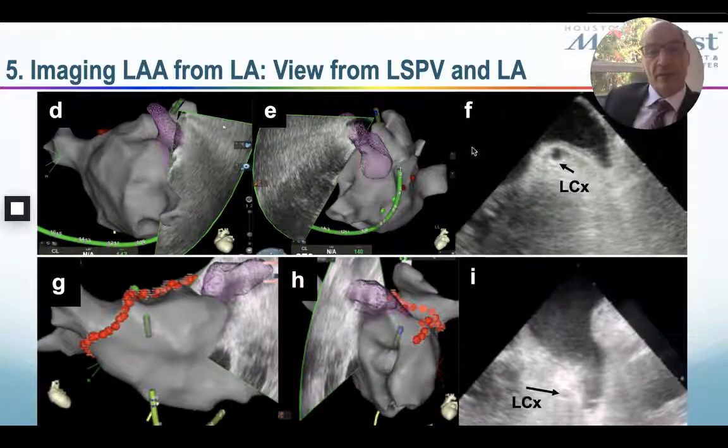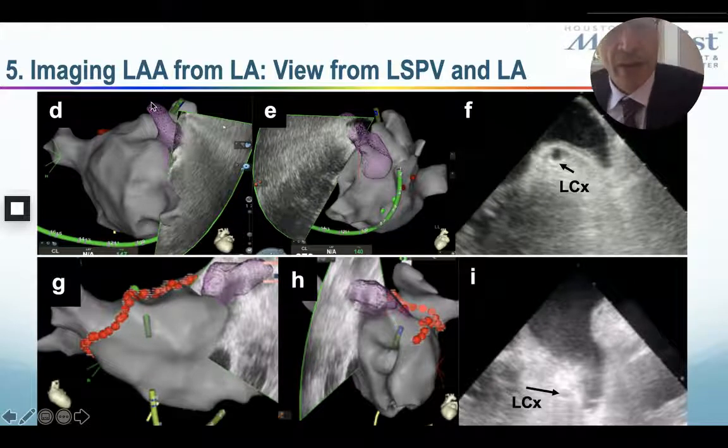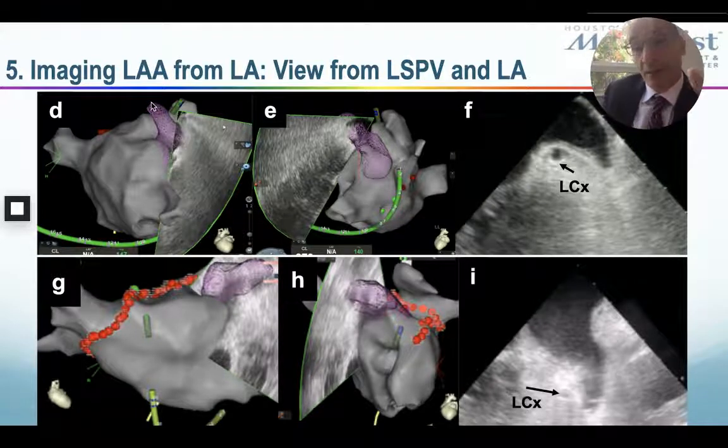And then you rotate the echo beam, and from this view, you see the appendage from behind it. You can rotate clockwise or counterclockwise to make this echo beam look lower or higher into the appendage body. And depending on the anatomy of the appendage, you may see different lobes with this view.